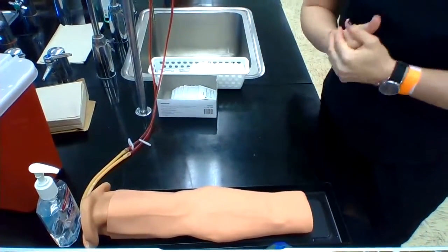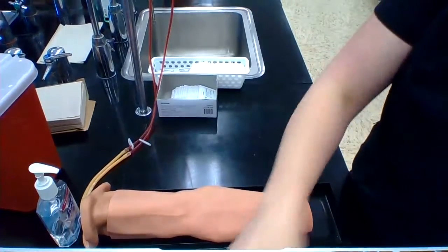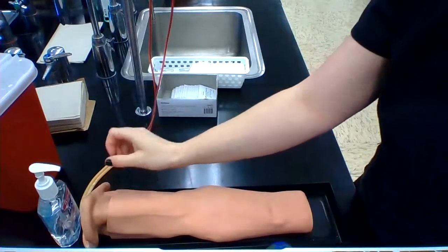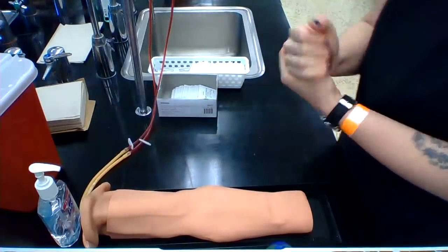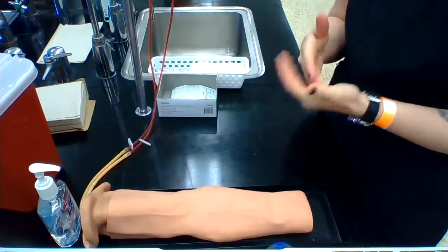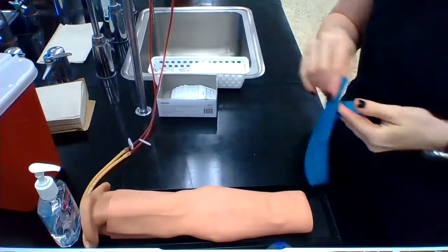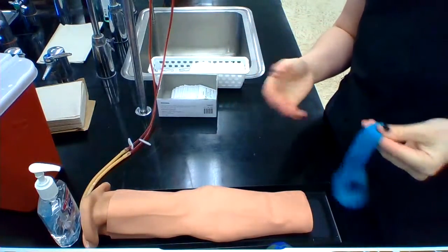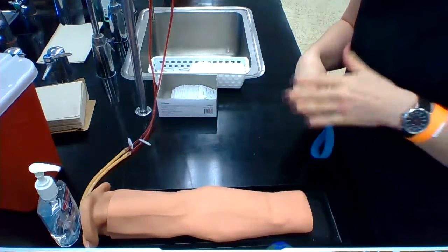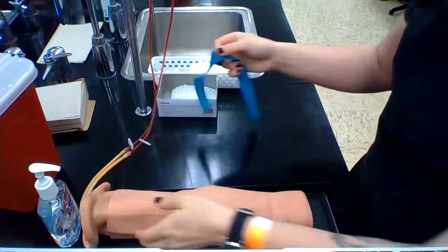We're going to do a vacutainer blood draw from the antecubital space right now. You're always going to start with sanitizing your hands. If you're doing this in real life, you would ask the patient to spell their name — you don't want them to just say their name. Ask them their birth date, ask them if they have a preference for which arm. Then look for anything to avoid like scar tissue, rashes, or injuries. You don't want to draw from a site that has those.